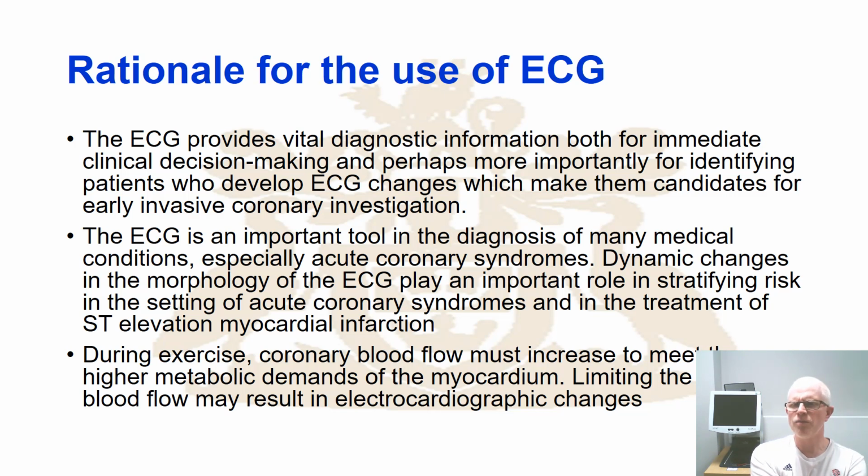it will be visible. So the reason that we do exercise stress testing, and this is something that will be covered in the podcast, which is the week 11 podcast, which is on CPET, which is cardiopulmonary exercise testing. The reason we take ECGs during those is that when we're trying to build up a holistic picture of the cardiopulmonary health of an individual, understanding how the heart is functioning when it's placed under controlled stress is fundamental.